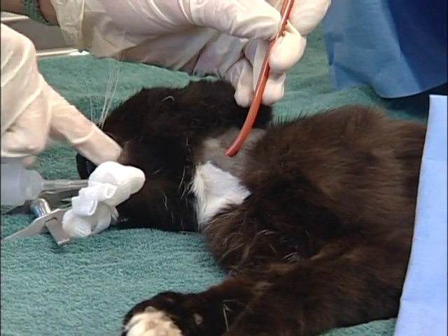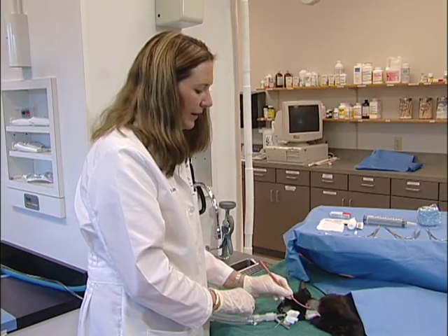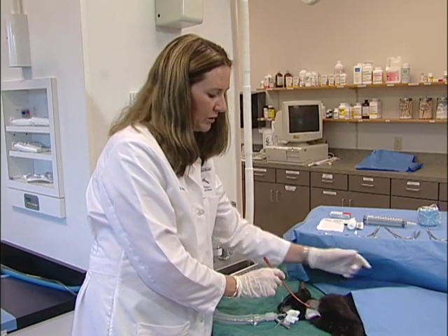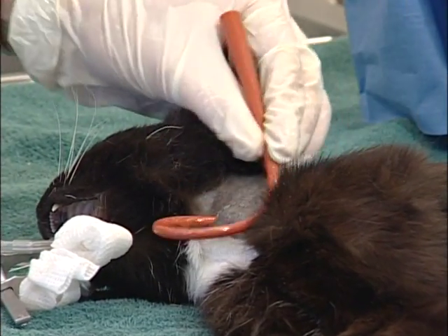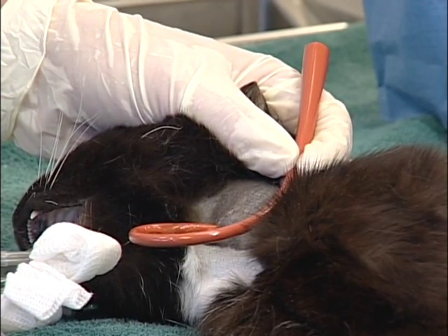You can use a guide wire or a stylet to help push the tube down into the esophageal lumen. Make sure you note the length of tube and how far down you want it to go. Once in position, if you have excess tube, you can sometimes form a loop and suture it in place, or alternatively, you can cut the tube to fit the length that you need.